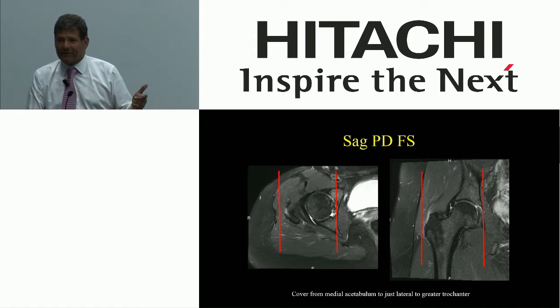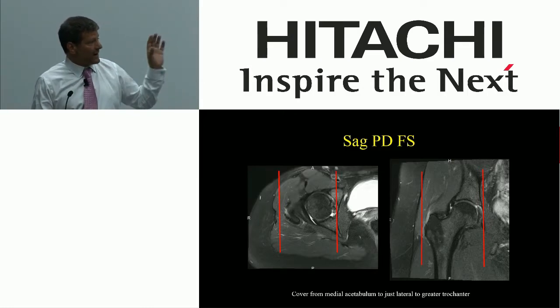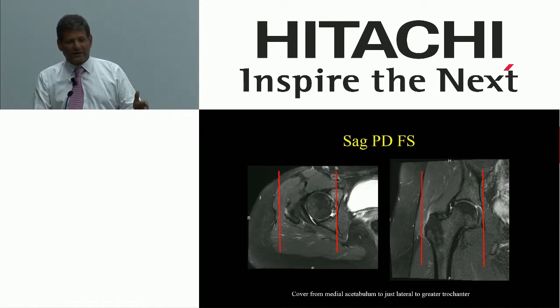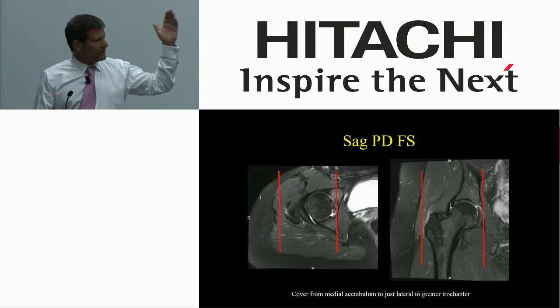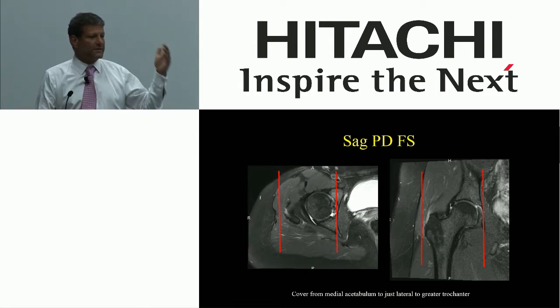This type of thing. We give them manuals. I like it right at the scanner. I'm not big on putting protocols down on a piece of paper. The scanner's got the protocols. But I am big on guiding the guys and taking the stress out of it. You know, there were technologists in the room. You know how stressful it is. Is the doctor going to come like, did I give him what he wanted? That's over. This is what we want. That's what you get. Phone calls stop. The stress drops. Patient focus.